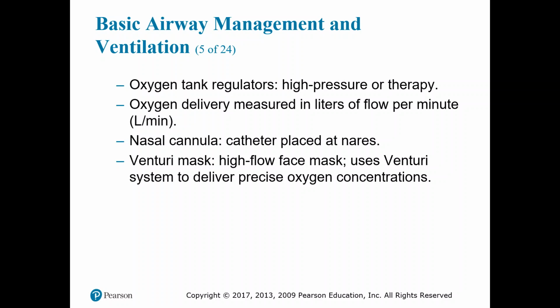The Venturi mask you don't see in the ambulance or the pre-hospital setting near as much, but they do show their faces around, mostly in the hospital, and mostly respiratory therapy uses them. The Venturi mask is a high-flow face mask that uses a Venturi system to deliver a relatively precise oxygen concentration, regardless of the rate and depth of the patient's breathing. As oxygen passes into the mask through a jet orifice at the base of the mask, it entrains room air, meaning it blends in, it's pulling in room air with it through the Venturi and mixing, and then delivers the resulting mixture to the patient.